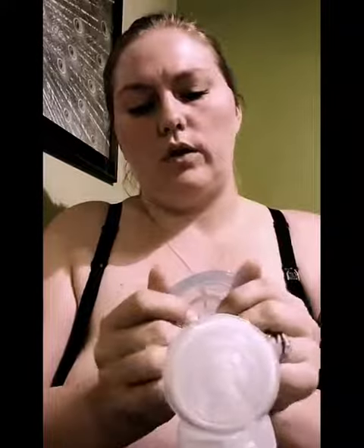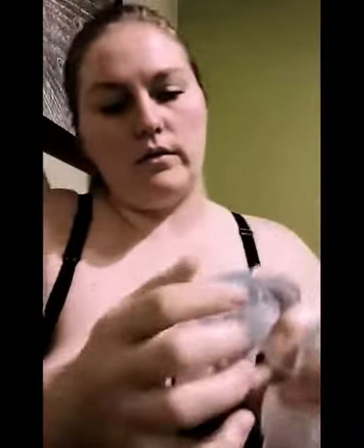You're going to want to flip this flange backwards to make an O shape like that. I mold it like this with my two fingers, and that kind of keeps it flipped back.